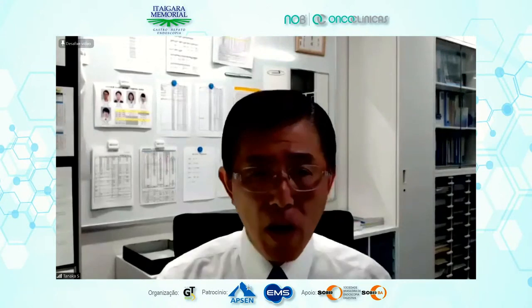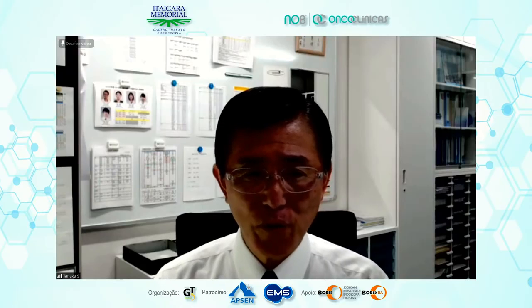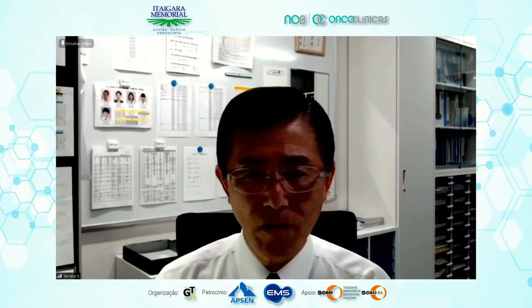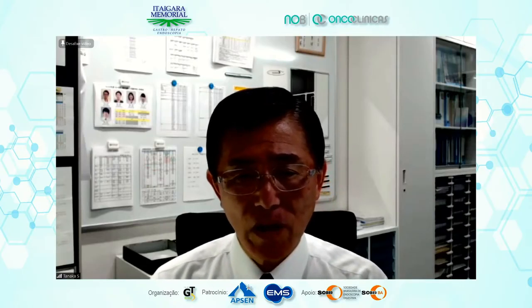Yeah, now AI is remarkably developing. Soon we can use it in clinical daily practice. Maybe IEE magnification will contribute to distinguish between neoplasia and non-neoplasia. So for the resect and discard strategy, IEE will contribute.